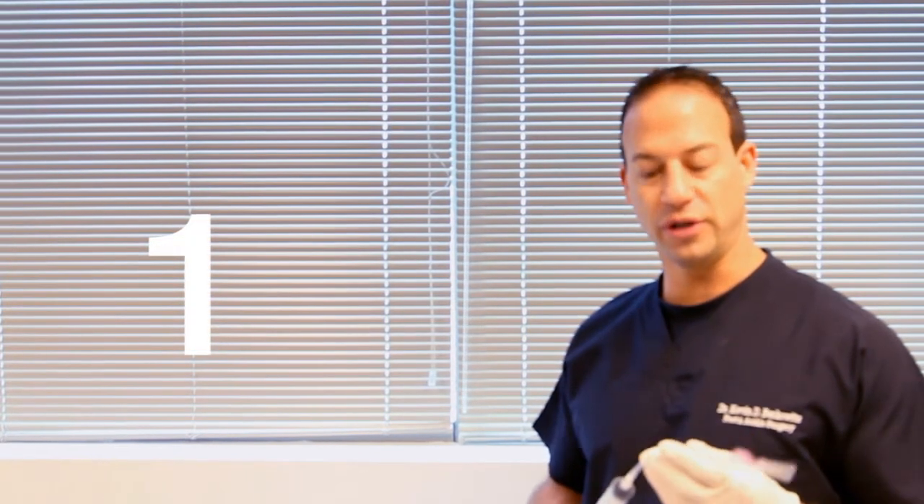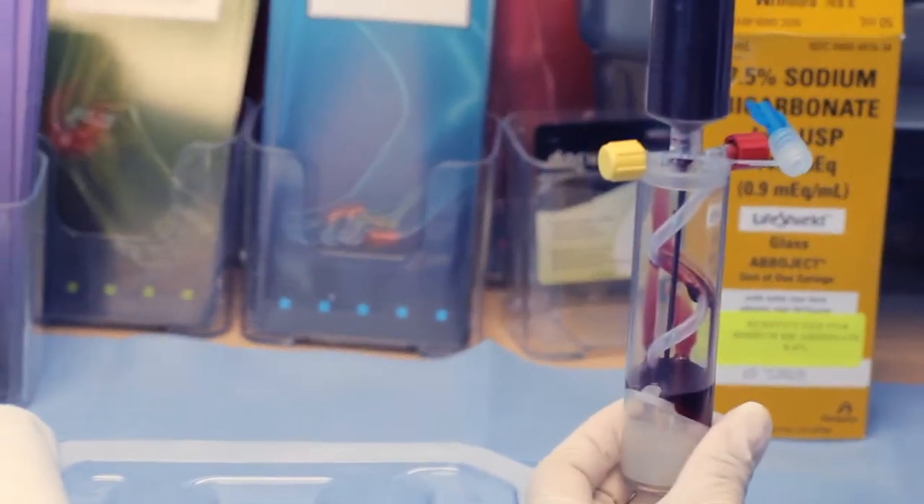Step one for PRP is a basic blood draw. We take 30 cc's — this is a 30 cc syringe — from the patient's arm, usually in the antecubital fossa, which is the inside of the elbow. Step two, we take the drawn blood and inject it into the mini separator.